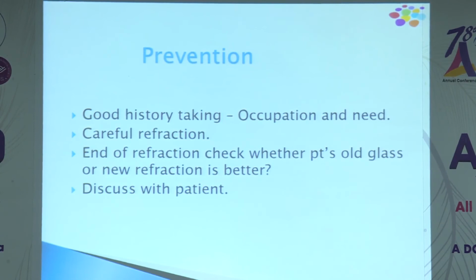At the end of the refraction, you should instruct your refractionist also to change to their old glasses and ask them whether this is better or the present refraction. That's a must for every case, and you have to discuss with the patient.